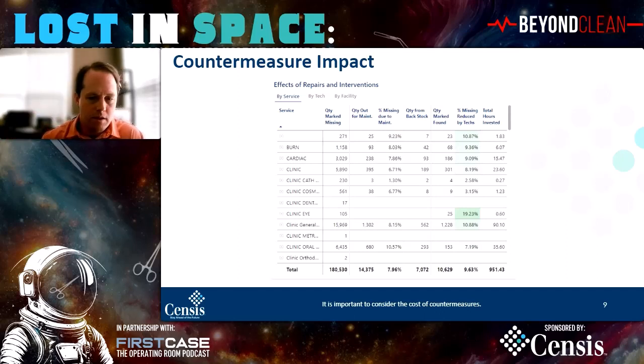Now you can go back to the OR room and say, look, we've got a scrub tech in this room that consistently mixes things up between trays. And as a result, here's the very real impact that has on our productivity. It's essentially an extra person every week just sorting these instruments out. If we put stuff back in the right trays, we're going to be able to turn things faster. They're going to be in better condition. It's much more likely that you're going to get what you need next time around. Like I said, ultimately, the patient is going to benefit from this.